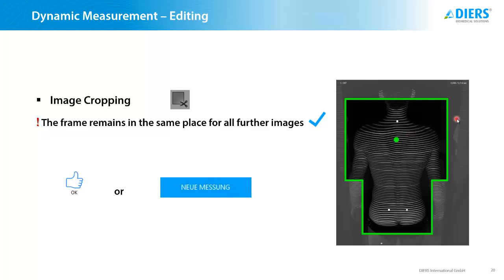If you get some reflections from the area around the system, you might crop the image. Image cropping means that you tell the system to look at a limited view in comparison to the complete view of the camera. This could always work to get a better and stable computation for analyzing.